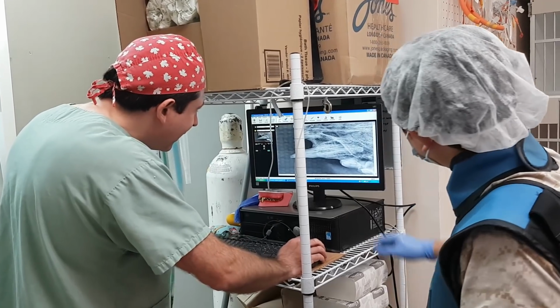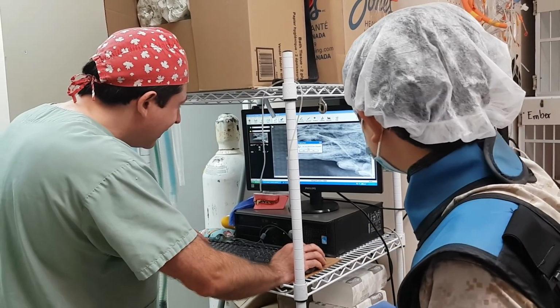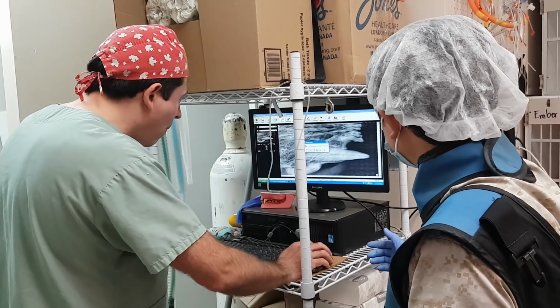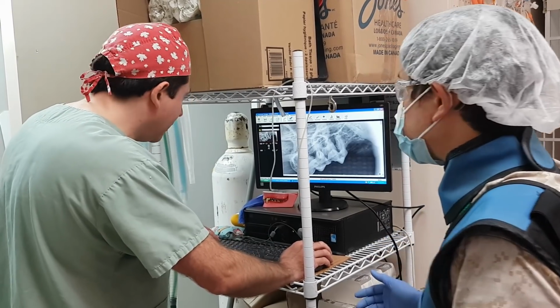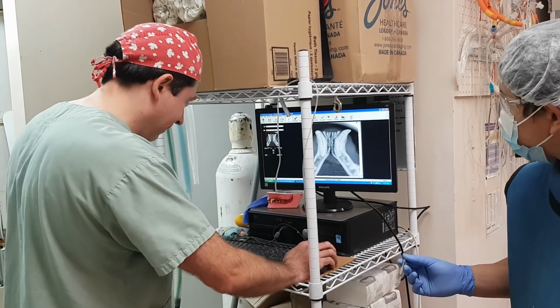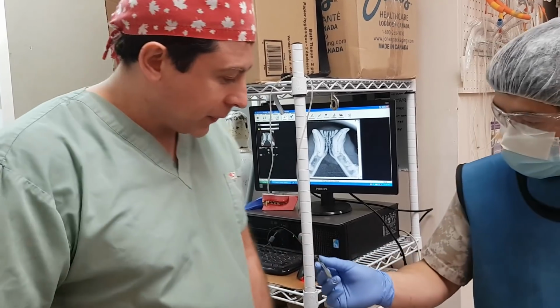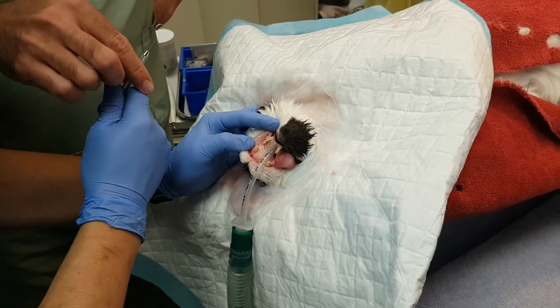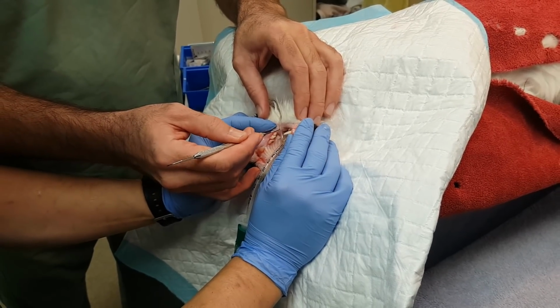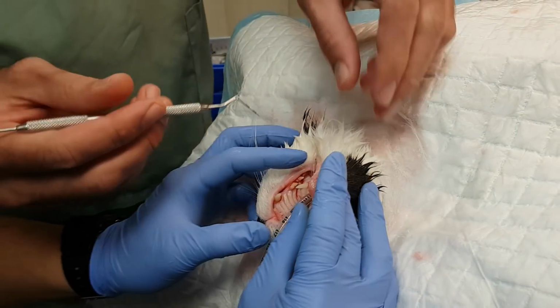It takes a little while to flip through all the parts of the mouth and make sure that every single tooth is fine. A lot of information you get from these radiographs, and you can't really assess a mouth properly without radiographs. Now we're going to go off and do a little bit of probing. You've got to correlate all that information you see from the x-ray with what we actually see in the mouth. So there we go, run a probe around every tooth, check the periodontal pockets, and this gives us all invaluable information. Together with the x-ray, we'll need to make a decision whether the tooth needs to come out or not.